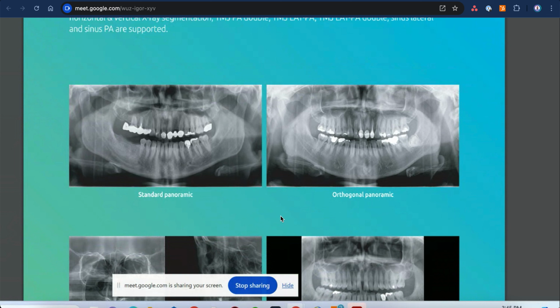It's also wheelchair accessible, right? For those who are in a wheelchair, instead of standing up, it's flexible to be used on the wheelchair. I will show you a picture and the other files where a wheelchair can be used, because I can control the level here.